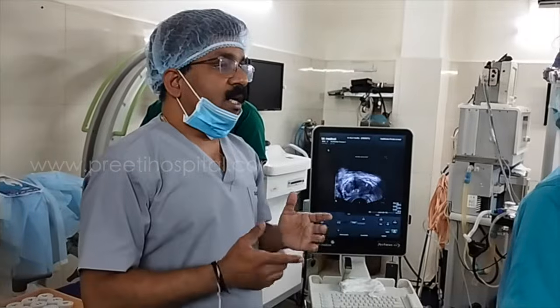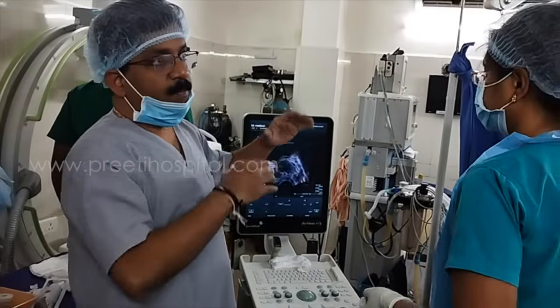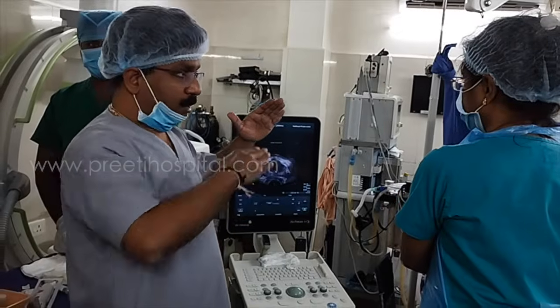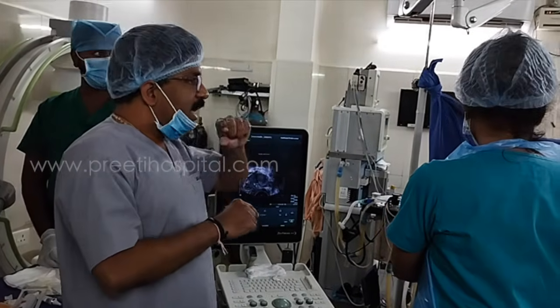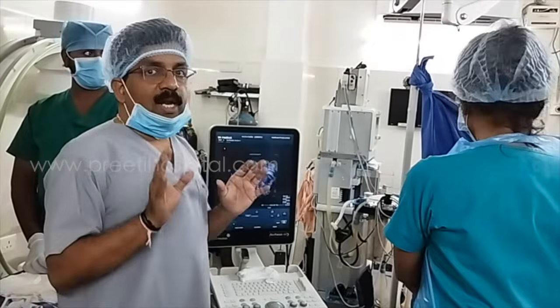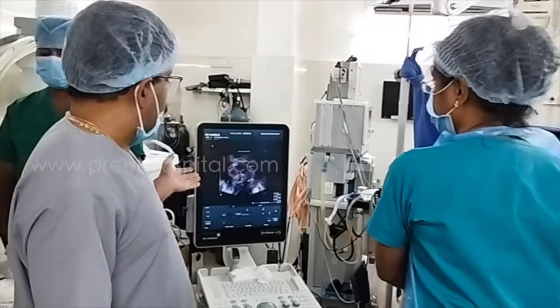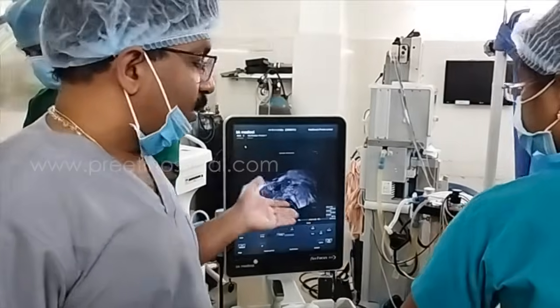What about the sagittal? You fire this vertically, so that the entire length of the piece will come. The transverse is only to see where the point is entering, isn't it? Now let us start the firing.